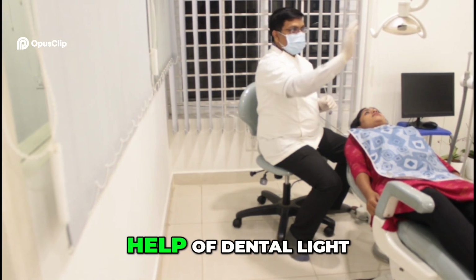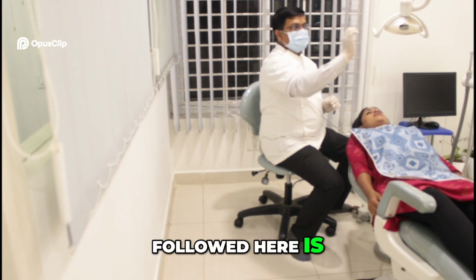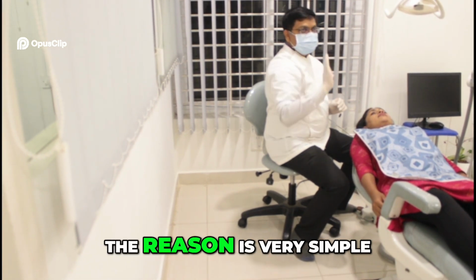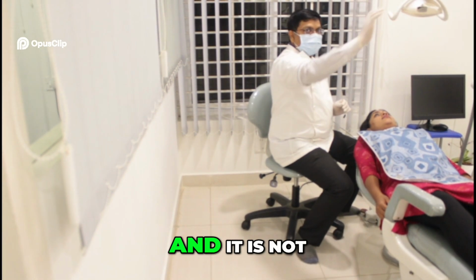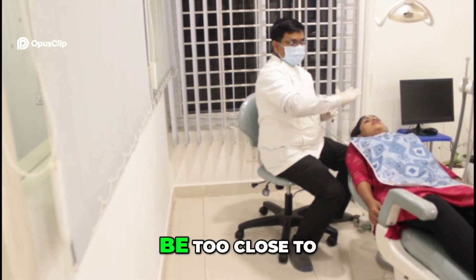Illumination is with the help of dental light. The first principle to be followed here is that the light should be one arm away from you. The reason is very simple. It is accessible to you if it is kept one arm away and it is not too close to the patient. Why should it not be too close to the patient?